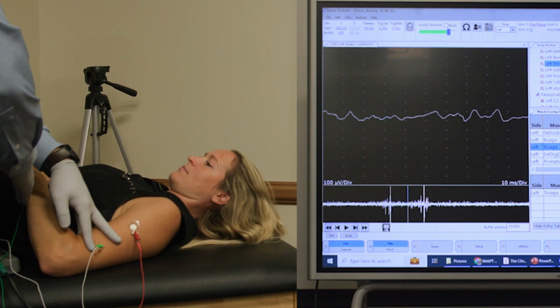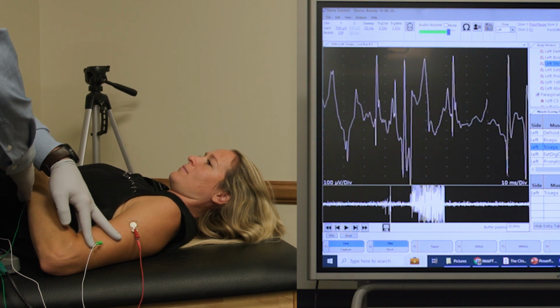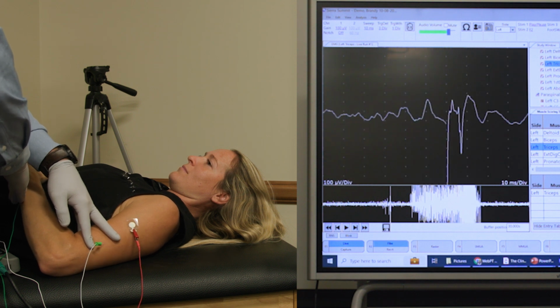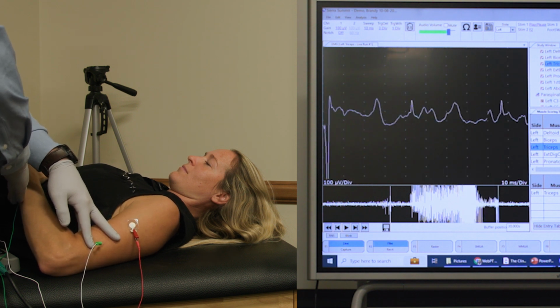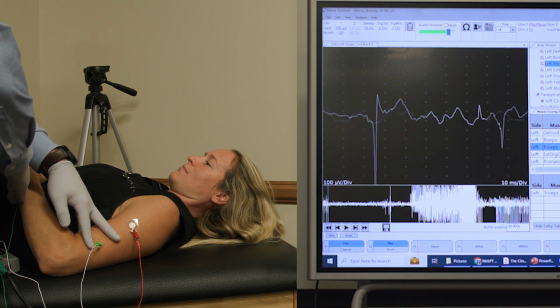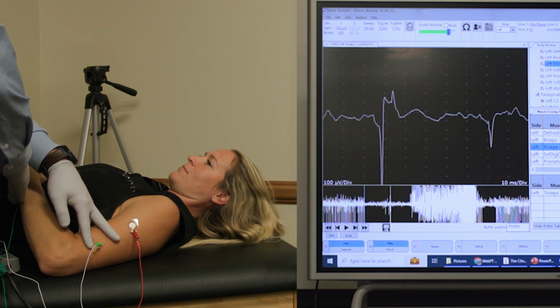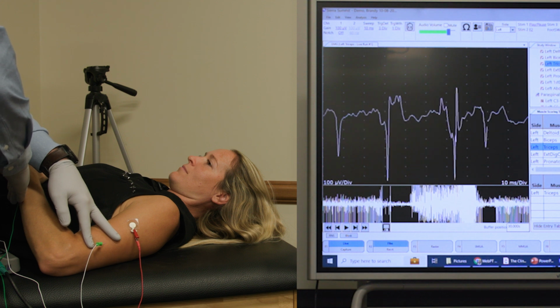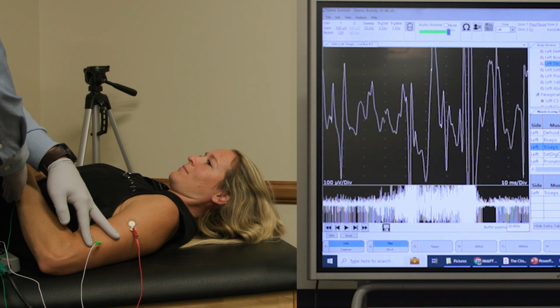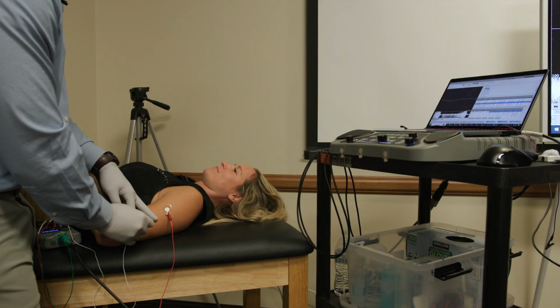Okay, now I'll have you push lightly towards your feet. And then give me a strong push now. Good. So start light again. So as one motor unit fires up, remember the more force you're trying to generate, the faster motor units fire and the more recruited. So go a little harder now. So now we get 2 or 3 motor units going, and then the harder she pushes, we get so many that we can't really distinguish them. And again, looking great there.